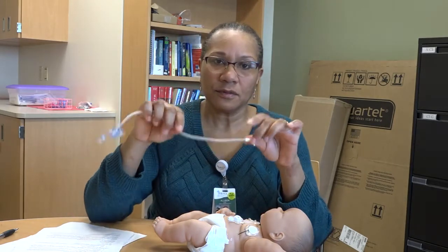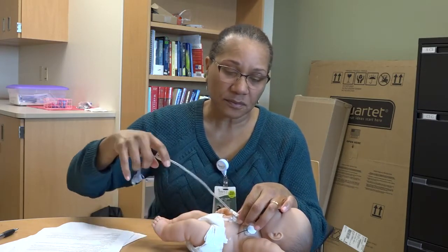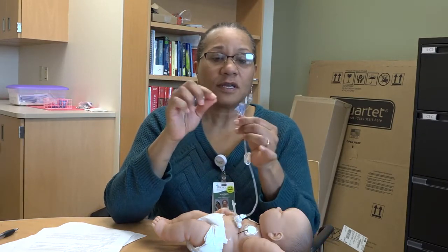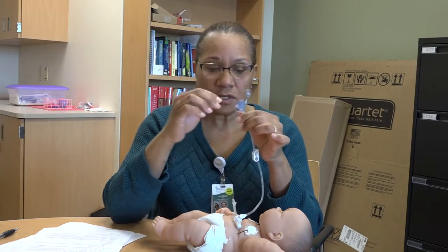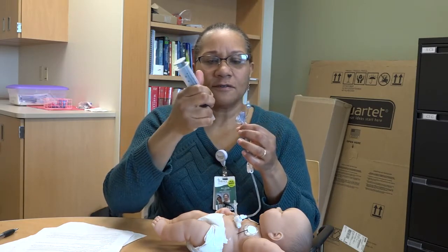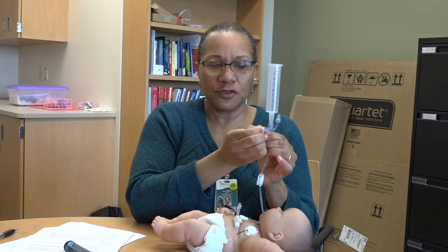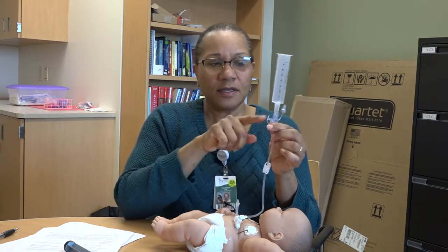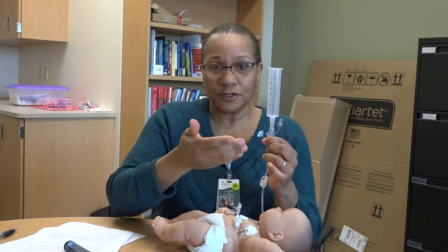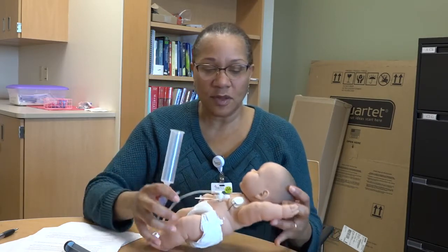So your feeding tube extension is already in place because you just got finished doing a feeding. And you're going to want to initially have your clamp closed and make sure that your medication port is closed, because formula can come back up, and instead of being in the control of your syringe, if this is open and you open up this clamp, of course the formula is going to take the path of least resistance and is going to roll out here instead of coming up, and you're going to lose your feeding.